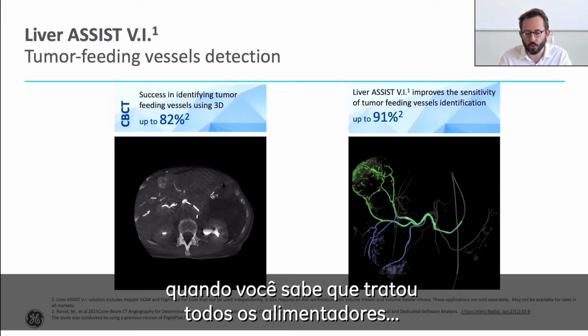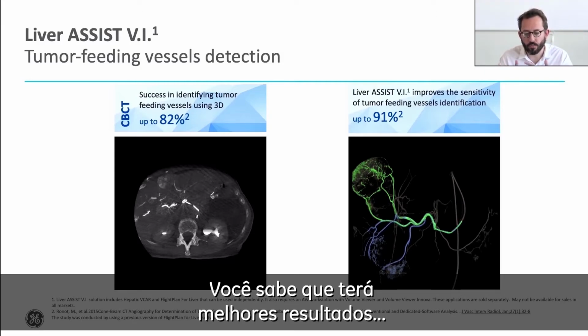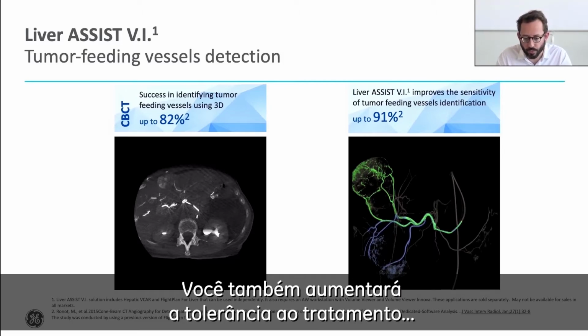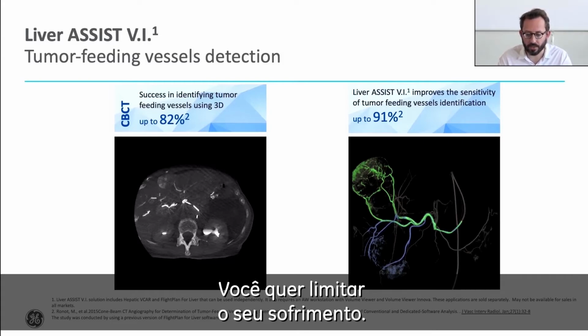When you know you treat all the feeders, you know you will have a better treatment, you will have better results, and you can be more selective, so you will also have better tolerance of the treatment, which is key for those patients that have cancer and you want to limit their suffering.